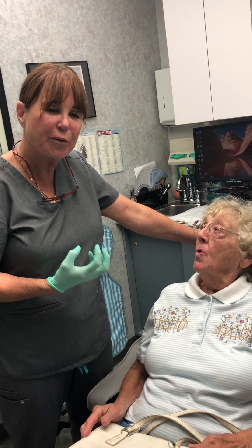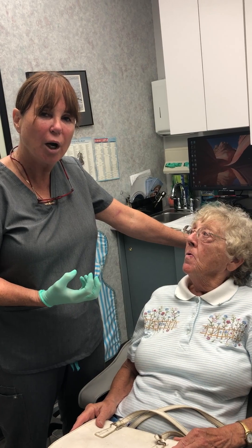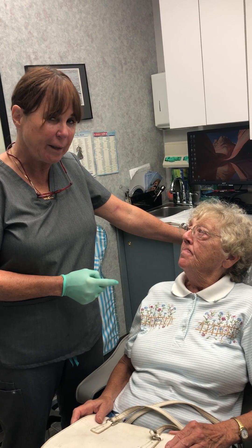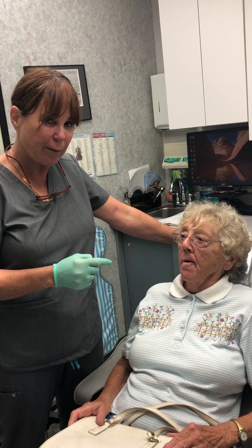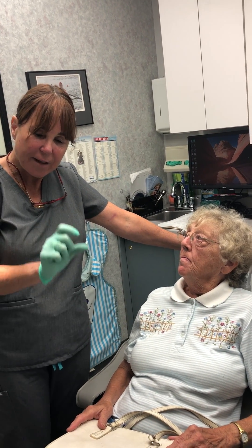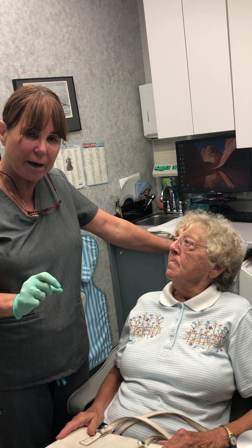Okay, now speak to us. And I tell you, it makes the world of difference. You can go out, you can talk to people, and I don't know what I'd do without one. See the difference in her voice, in the tone of her voice — she has more power in her voice. Absolutely. So this allows her to speak clearly, and I'm sure that if she were to eat and drink, fluid would come out her nose without the tail portion you saw on that obturator.